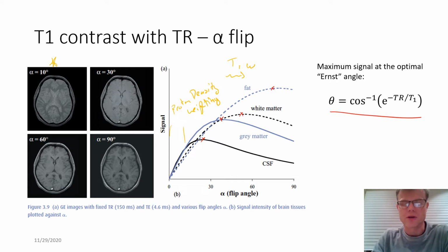This is the so-called Ernst angle, named for the person who derived this principle. And you guys have seen that in the homework a little bit as well already.